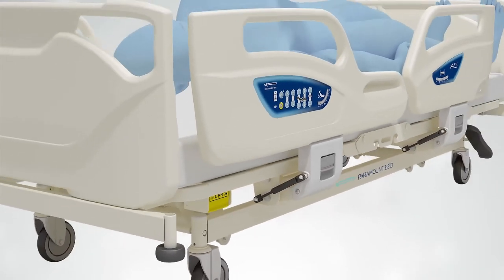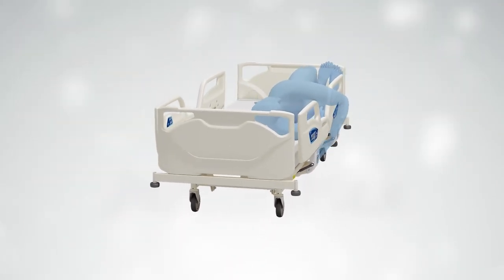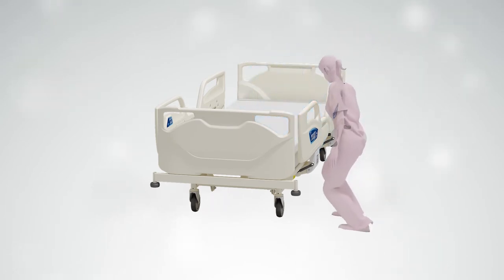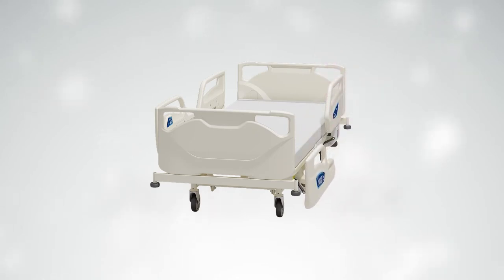An anti-tampering lock on the side rail has also been installed for the patient's safety. If a patient attempts to lift the side rail themselves, the lock will activate and the side rail will remain firmly in place.